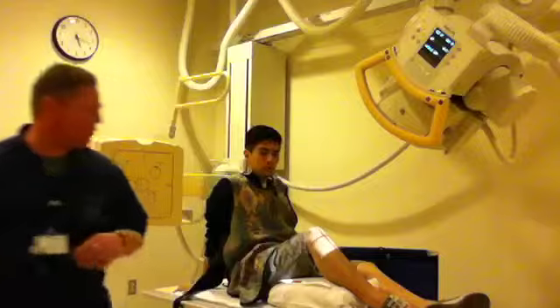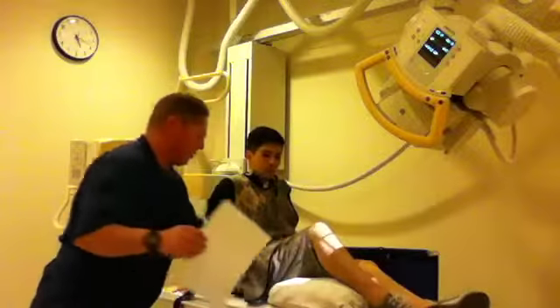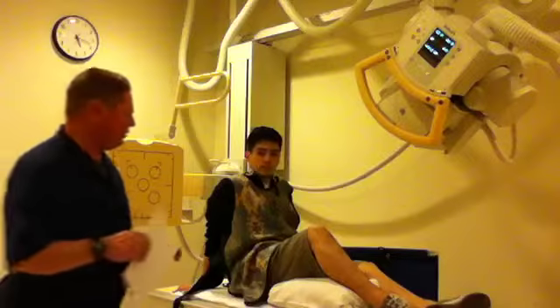And hold still, back, shoot, and then check to make sure I got it.